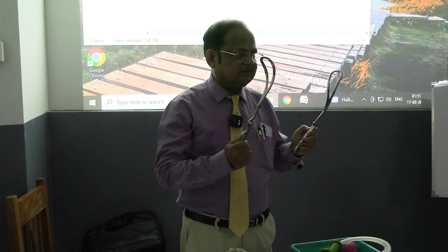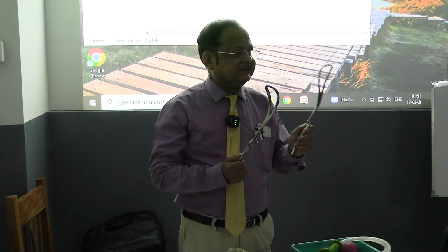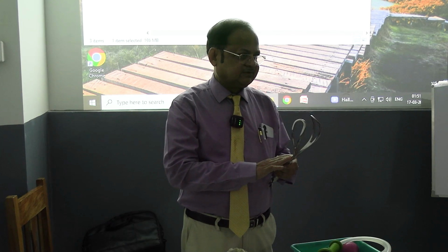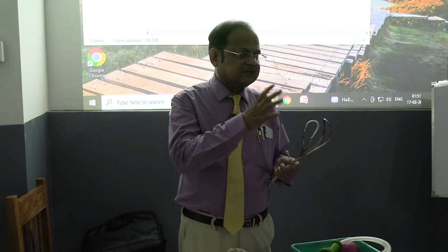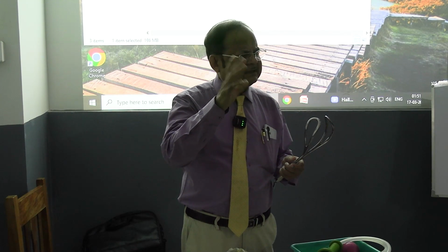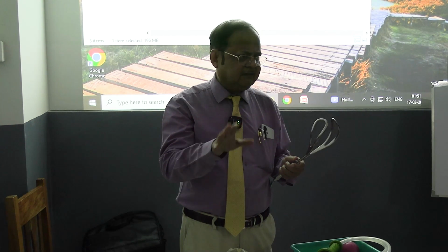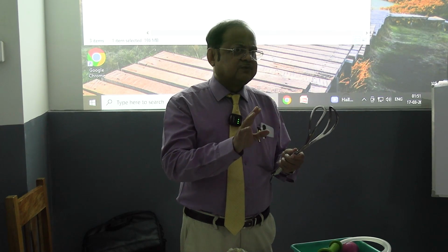This is the obstetric forceps. One half is called a branch. This is actually a long curved obstetric forceps. There are different types of obstetric forceps. One is the short curved obstetric forceps. A few hundred forceps, 500, 600, have been discovered since 1600, starting with the invention of the Chamberlen family. But there are commonly used forceps.